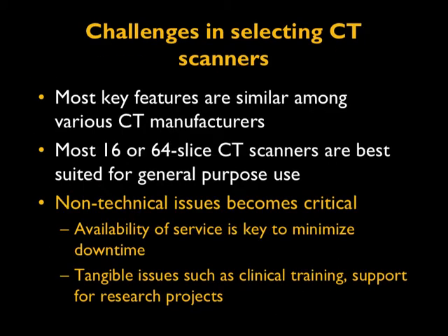What are the challenges in selecting CT scanners? If you look at the type of CT scanners available these days, it's very difficult to differentiate the good ones from the bad ones. They all look good on paper. So the key features are similar among various CT manufacturers.